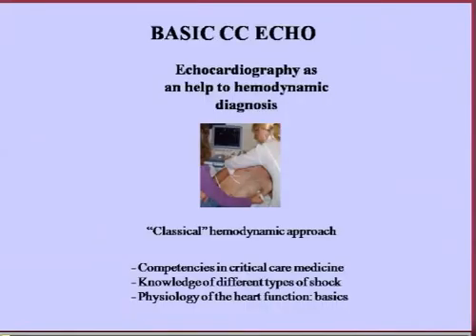The first level is the basic critical care echocardiography. In this situation, you can use echocardiography as a help, only a help to hemodynamic diagnosis. Most of the time it's by using a transthoracic route, and it's more a classical hemodynamic approach.